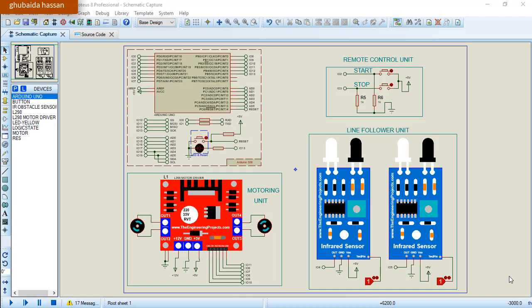In this video, I'm going to show you how to simulate a project known as a remote controlled line follower wheelchair. Pretty good. So, this project will have four main units. As you see here, we'll have the MCU itself, the microcontroller. And we will have the remote control unit, a line follow unit, and the motoring unit.